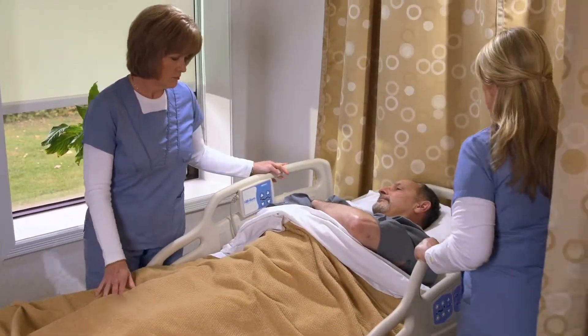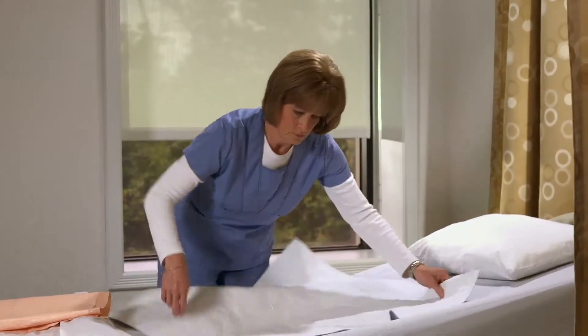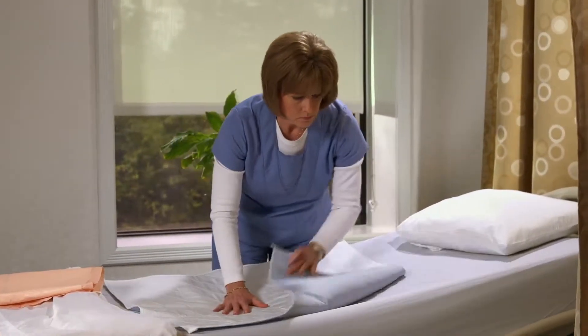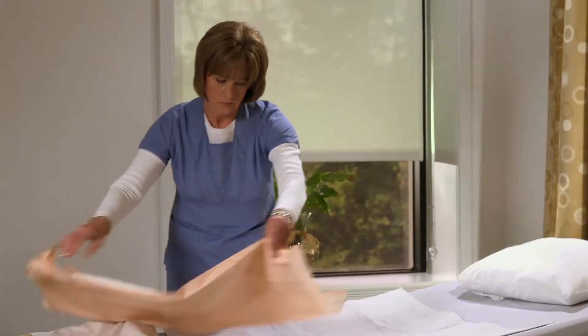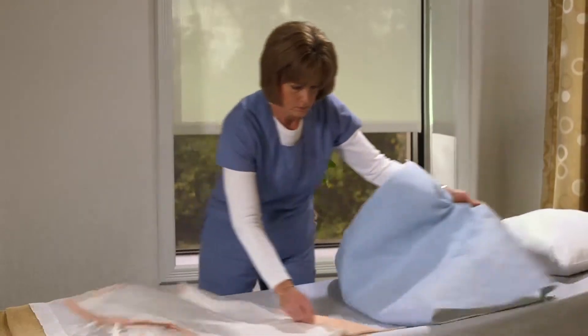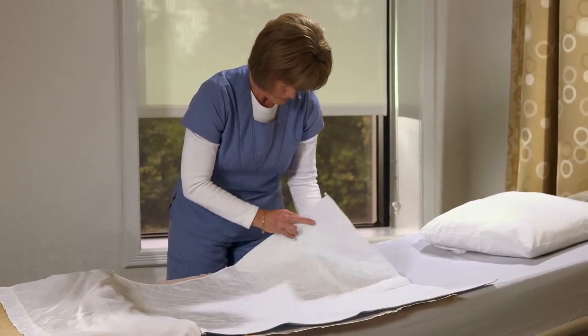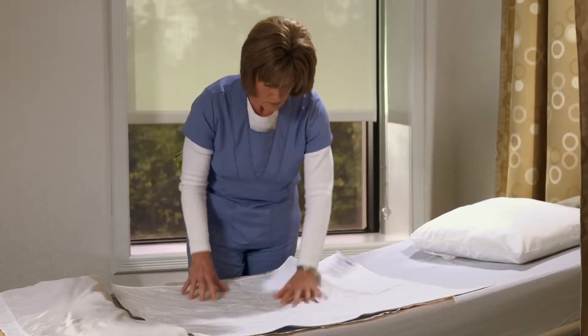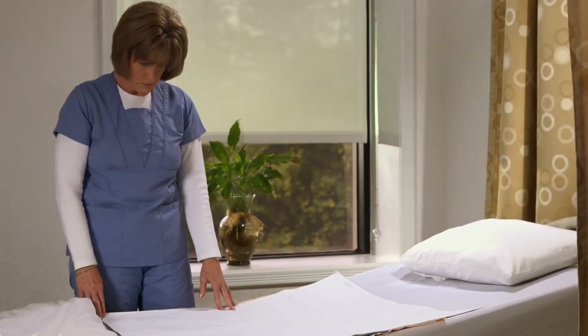If the patient experiences large volumes of incontinent diarrhea, urine, and or weeping edema, using a disposable pad in conjunction with the Dermatherapy underpad is at the nurse's discretion and is proven to be an effective combination for those particular cases. The primary objective is to keep the Dermatherapy product in contact with the skin as much as possible while keeping the layers underneath the patient to a minimum.